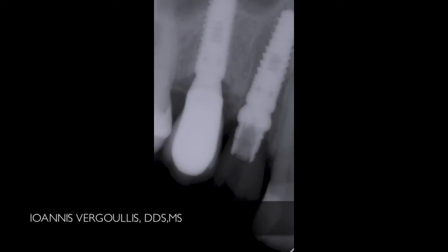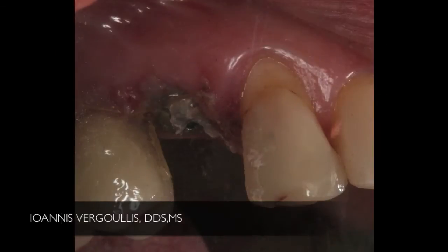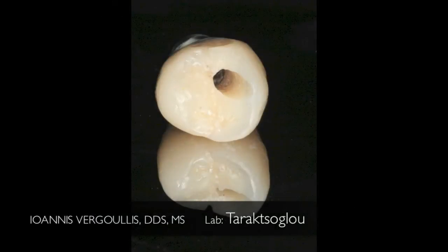As you can see here, the root was removed atraumatically and we immediately placed a Legacy 3 4.2 x 11 mm implant, slightly angulated in order to avoid the sinus and get primary stability. We took an impression and then placed a healing abutment. Within 24 hours, the lab was able to fabricate a cemented screw-retained temporary restoration made out of composite, utilizing the abutment that comes with the Legacy implant.